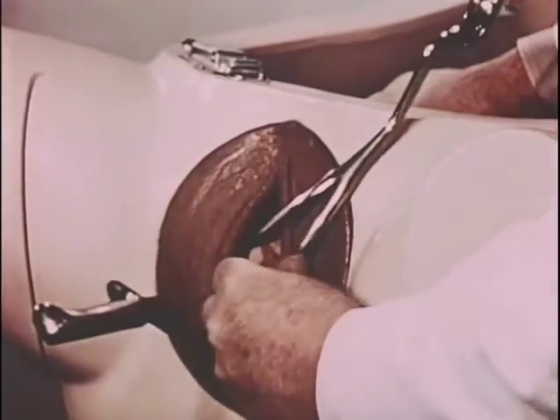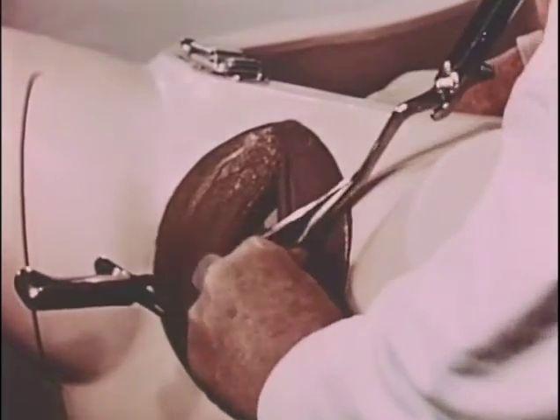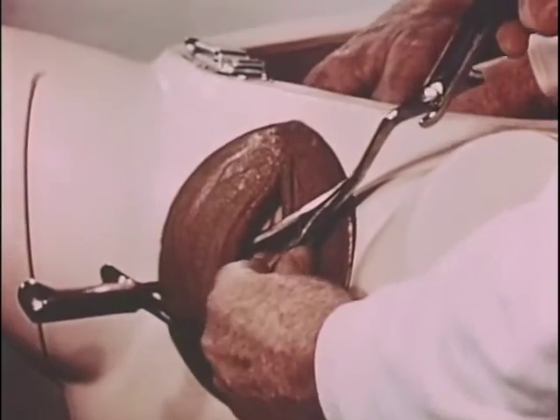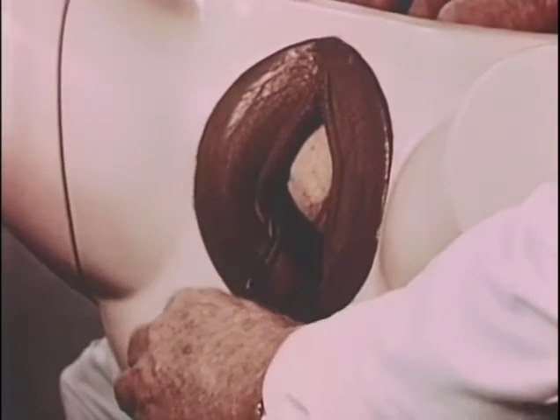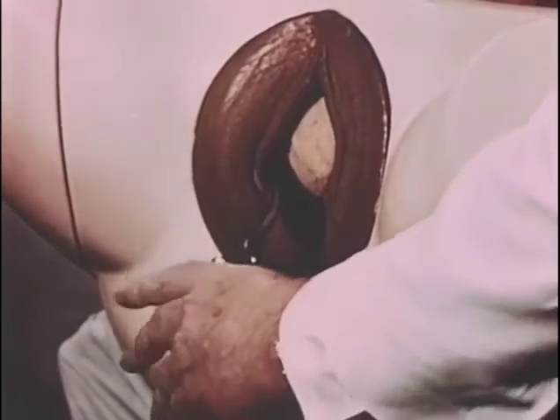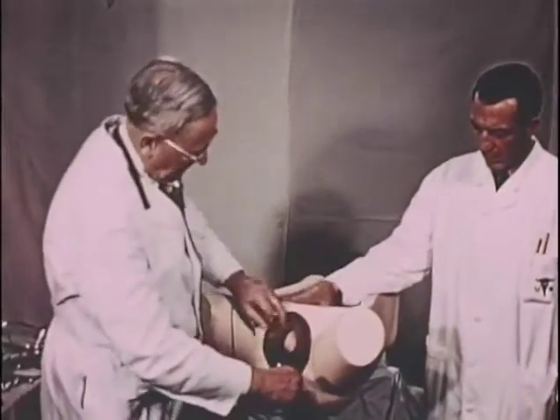And the thumb is placed on the heel. All force is applied at that region rather than at the handle. And as the blade enters the vagina, the fingers displace the thumb at the heel, and the handle is brought around opposite that of the posterior blade. Then locking is accomplished, and the application is checked.